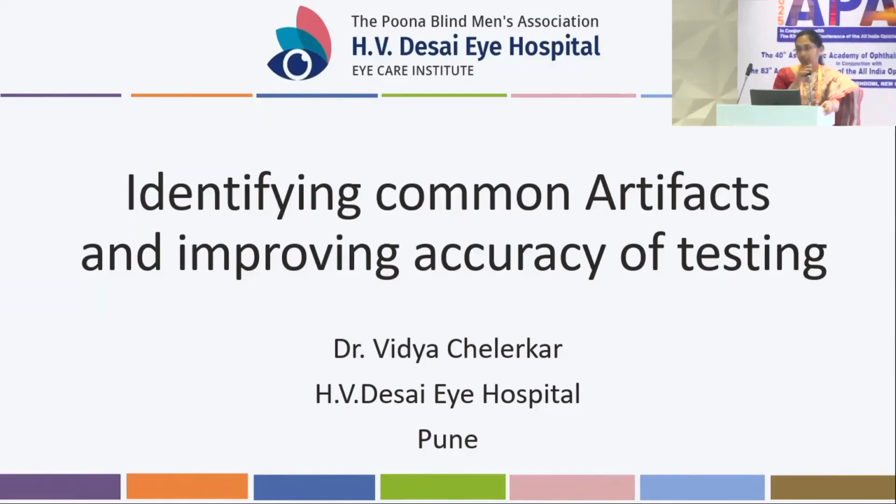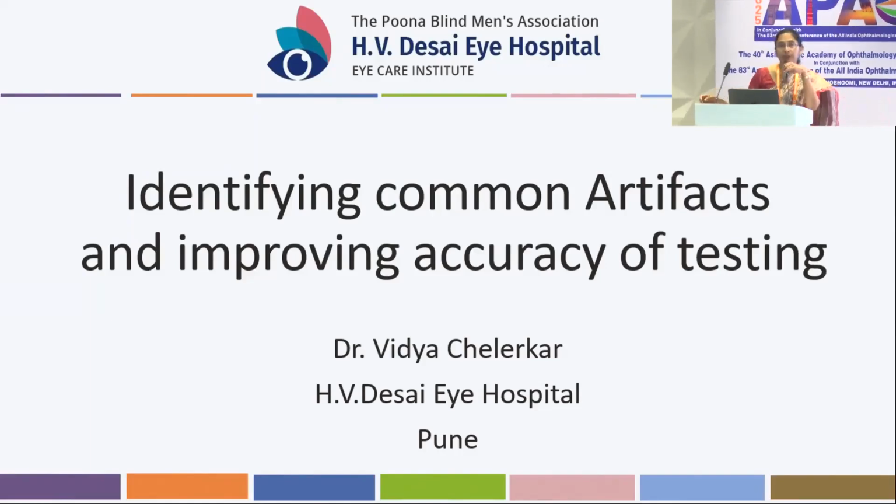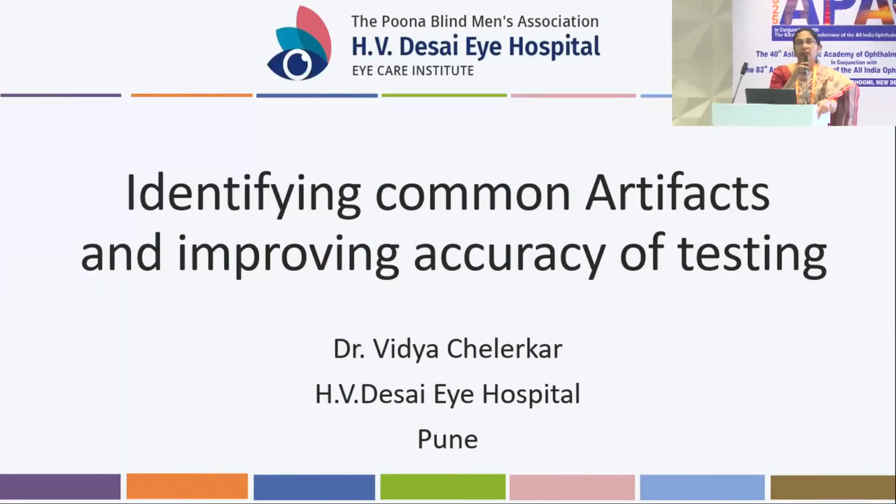So artifacts are non-pathologic field defects which may mimic glaucomatous field defects but are not due to any pathologic change or any pathology in the visual pathway, but they are due to performance errors or some difficulties during performing the test.